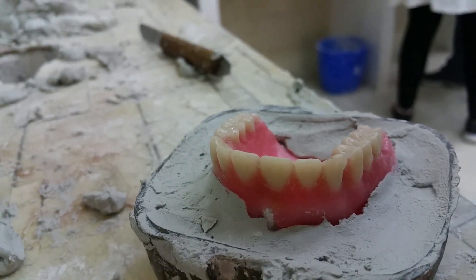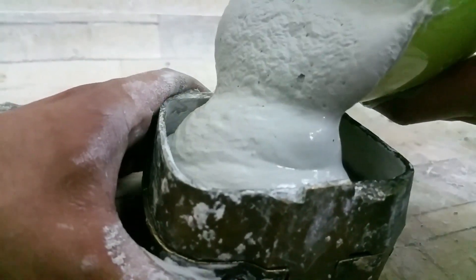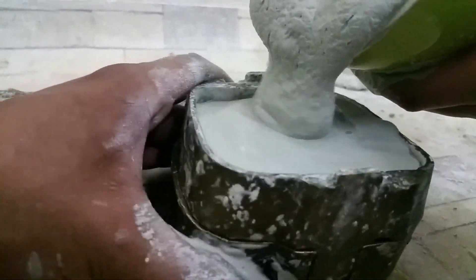We wait for the gypsum to dry. Once dried, we proceed to isolation — in our case we isolated using soap water, literally a mixture of water and soap. You place the model into the mixture and move it about for about five minutes. Once fully isolated, we bring it out of the soap water and fill the rest of the flask with gypsum, making sure to cover all the parts.